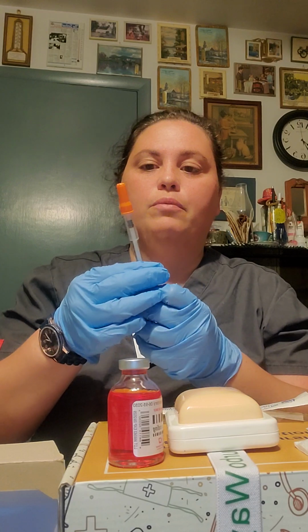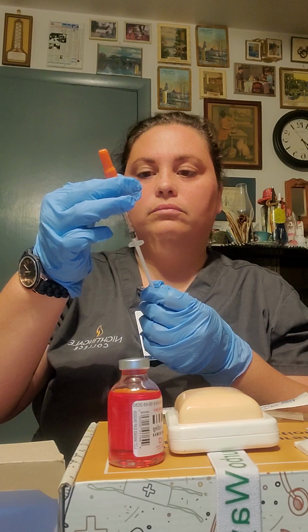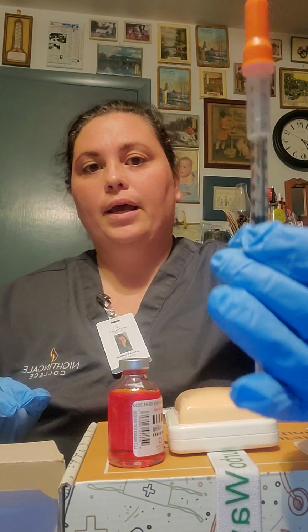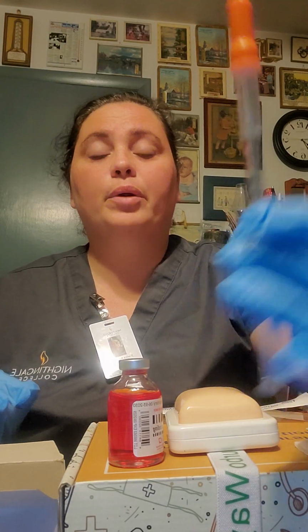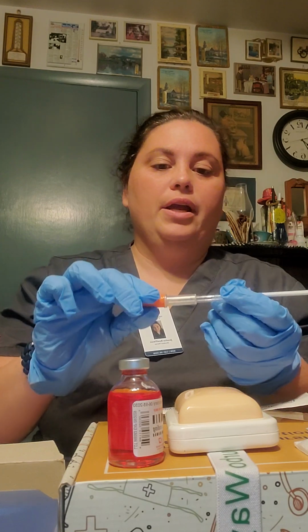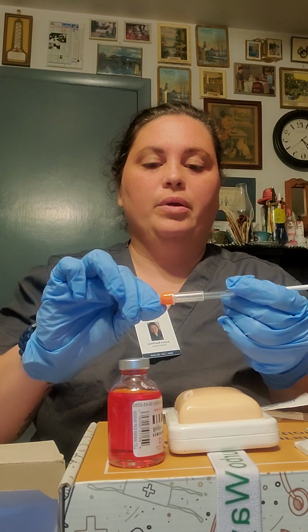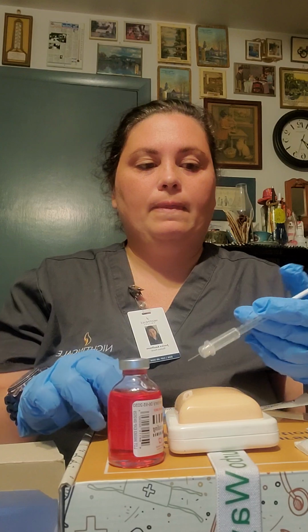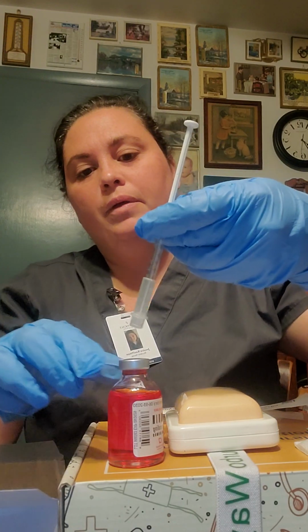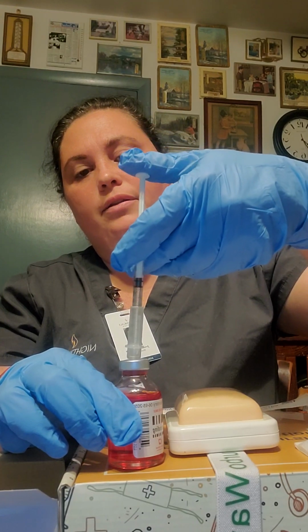And I am going to pull back 1 ml, because that's what the order is, 1 ml of heparin. Right, so I'm going to open the cap. I'm going to insert the needle. I'm going to inject the air.